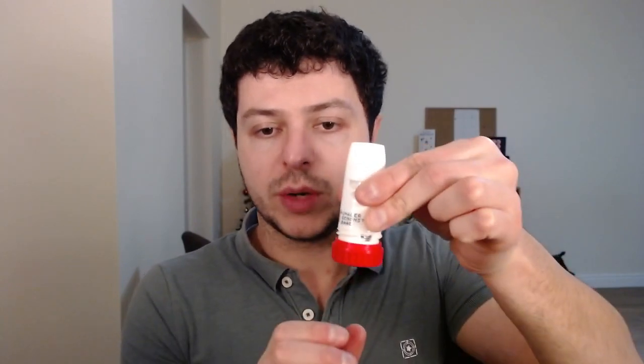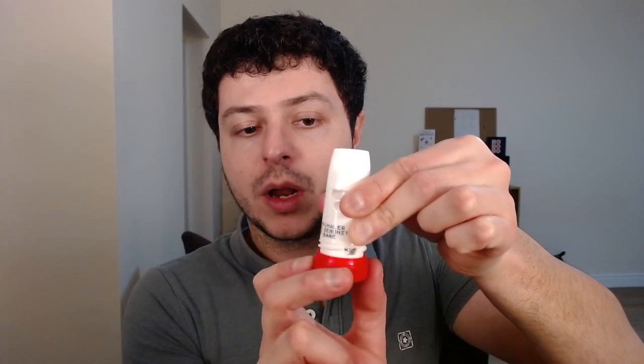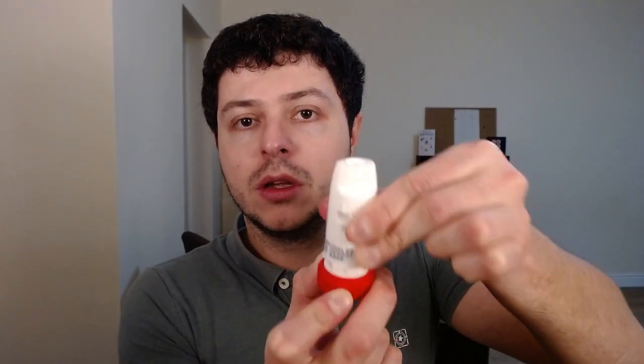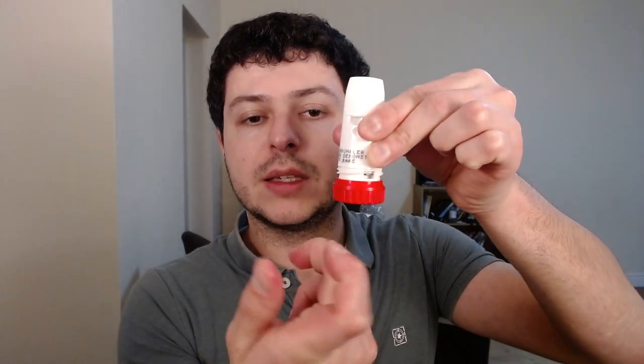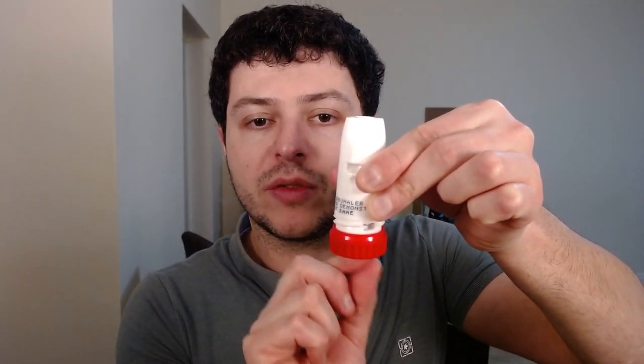This is the mouthpiece from which you will be inhaling the powder. Now this isn't ready to use yet because there's an extra step. When you're ready to use the inhaler, you need to activate it. You hold onto the white part, grab onto the red bottom, and twist it clockwise and then twist back — and it will go click. Once it's done, it's ready to use.